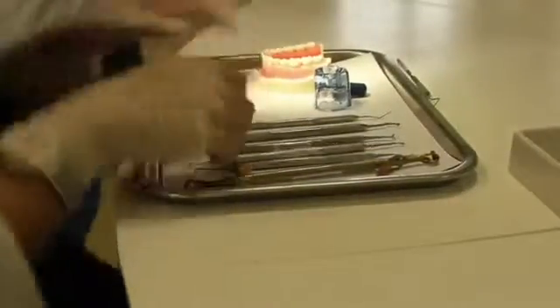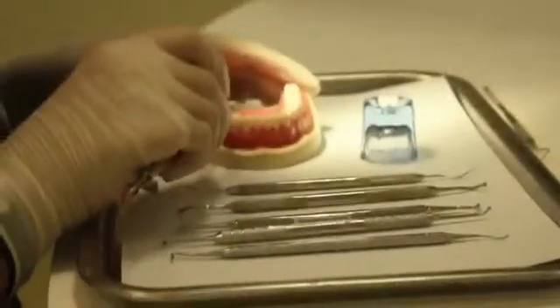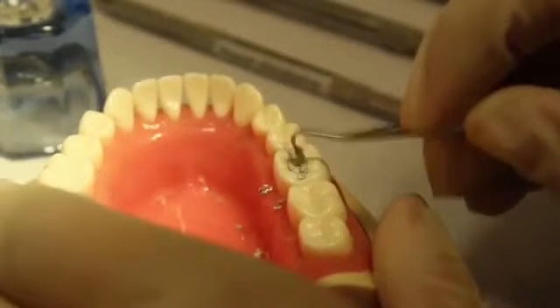Using an amalgam carrier, place the amalgam into the cavity. Remember to place the amalgam in increments. Between each increment, make sure to condense the amalgam into the cavity to adapt it into the walls.